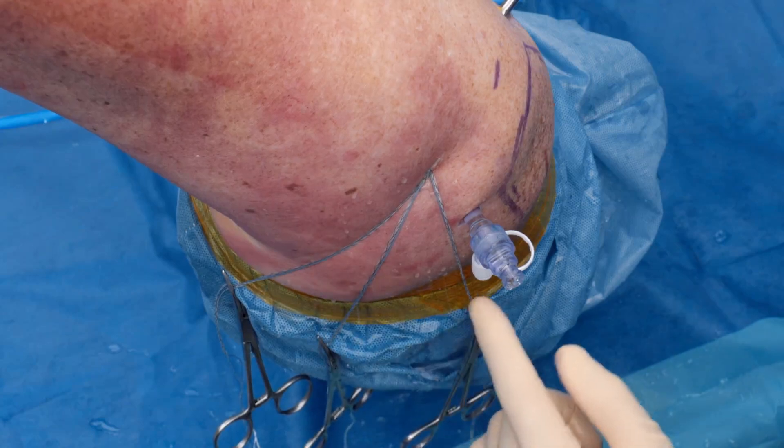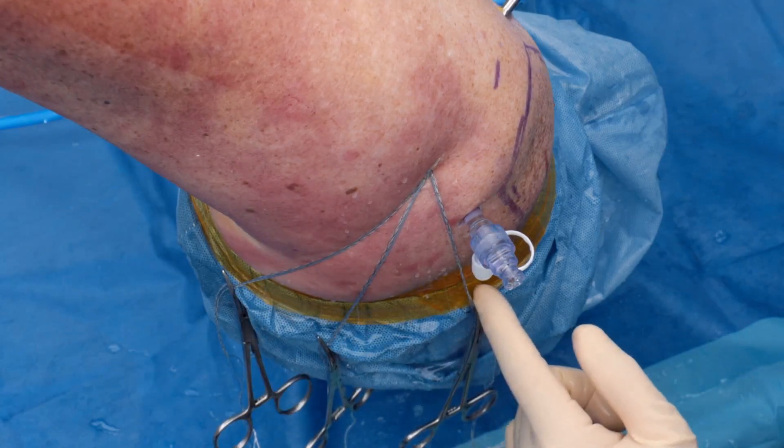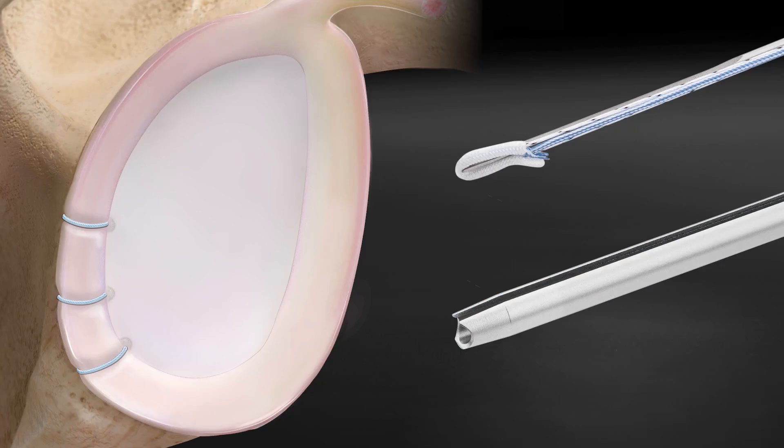Disengage one set of sutures at a time during the passing and completion of the instability repair. So we performed a posterior labral repair using the slotted drill guide, which allowed us to place multiple knotless fiber tack anchors through one percutaneous portal without removing the guide, simplifying our workflow and allowing us to get an anatomic posterior labral repair.